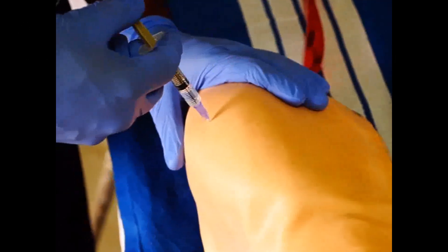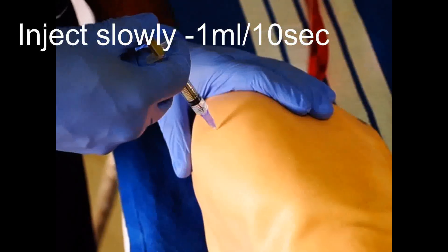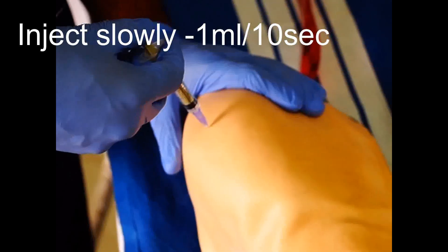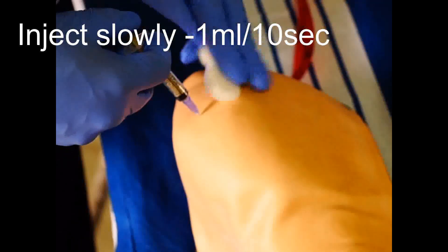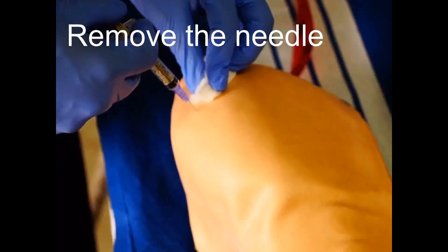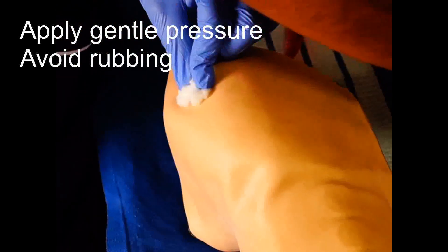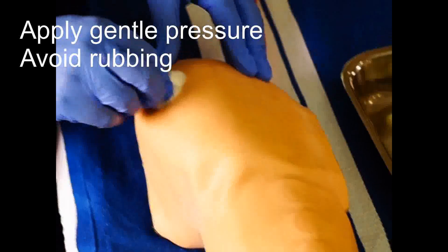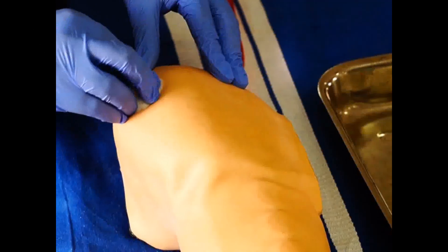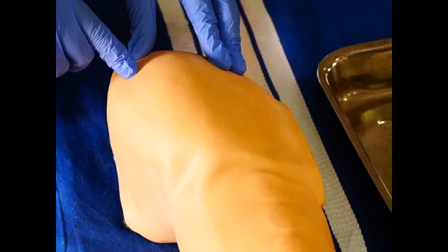Aspirate to ensure the needle is not placed in a blood vessel. If blood appears, remove the syringe and prepare a new injection. Inject very slowly, around 1 ml per 10 seconds. After injecting, remove the needle immediately and apply gentle pressure at the site. Avoid rubbing. Check for any bleeding.